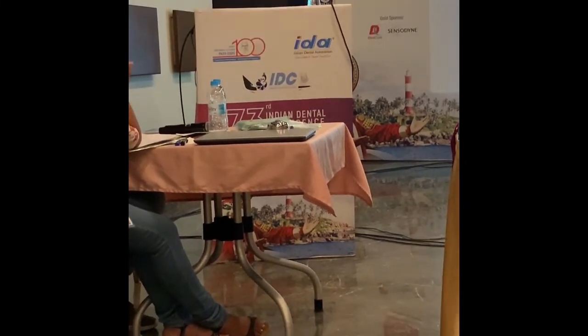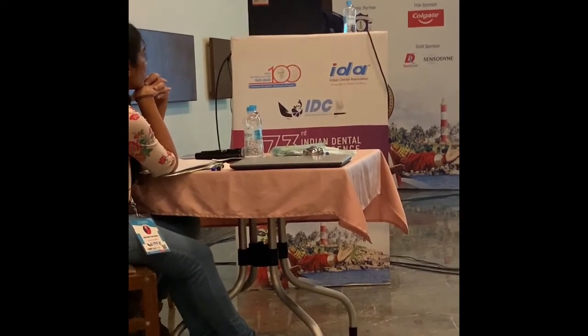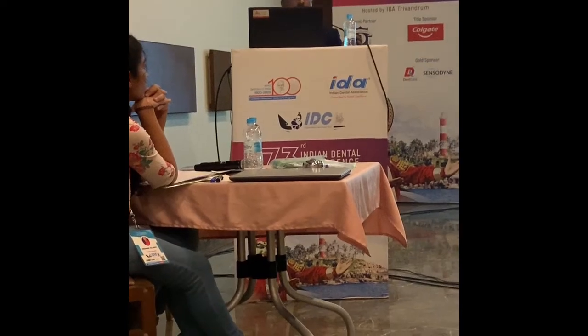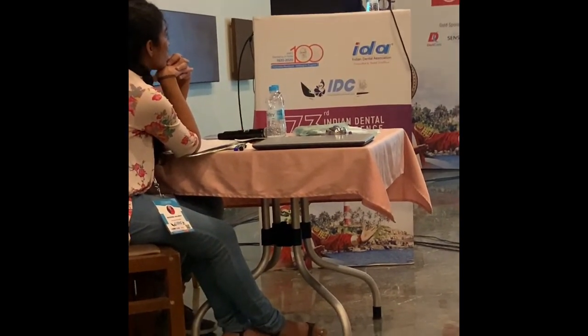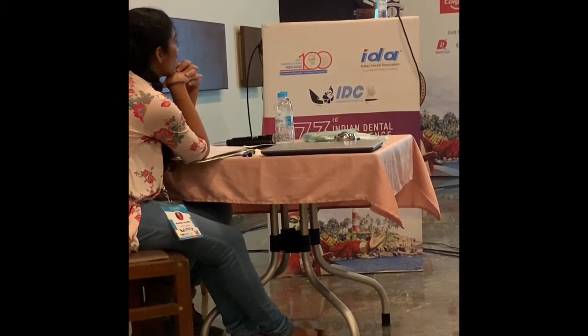The patient had a history of trauma, he has got a lot of bone loss, and the patient wants the implant immediately. See, all the techniques in dental implantology have been formulated in a way to finish the treatment quickly. Before, if there was bone resorption, you would take an iliac bone graft and build up the bone. Imagine a 65-year-old man who lost all his teeth: you put him under general anesthesia and take an iliac bone graft. Just to walk properly itself is going to take another 10 days, and convincing the patient is going to be really tough. That is why all-on-4, all-on-6, all these techniques have come, to help make the treatment as quick as possible.